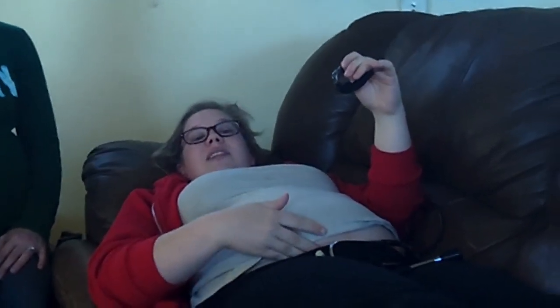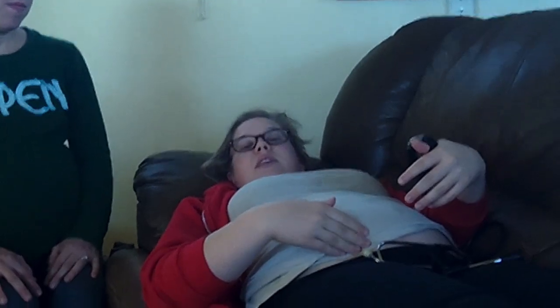If you find something in that 120 to 160 range, really clearly, that is your baby's heartbeat. If you found something slower, like in the 70 to 90 range, that would probably be your pulse. The way you would distinguish between them, if you were confused or just wanted to confirm, is that while you or someone else, maybe your partner, is listening to the baby, you can feel your pulse at the same time. And if they're different, then they're two separate hearts beating. Cool. What a miracle.